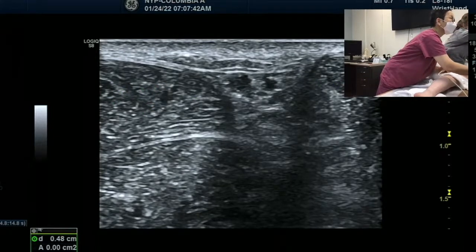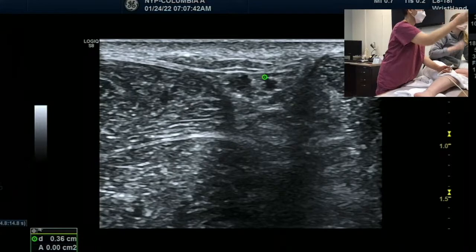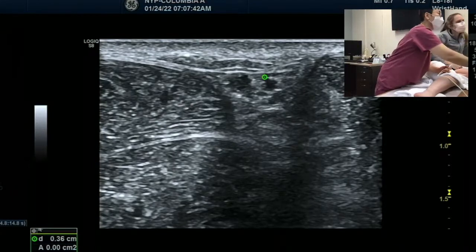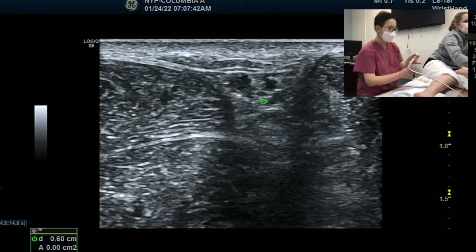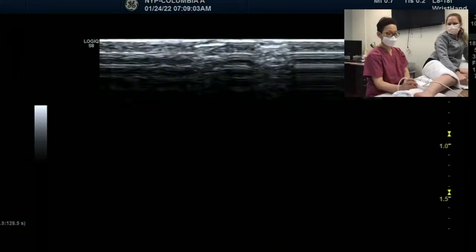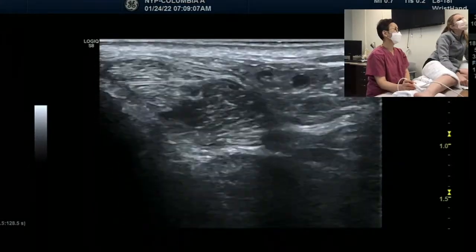Why is it so bright right here? Is that part more like membrane, the vessels? We can go around, but look at all the bright colors around. If there's not a lot of water, then it's going to be more whitish, right? Actually, not that white much.